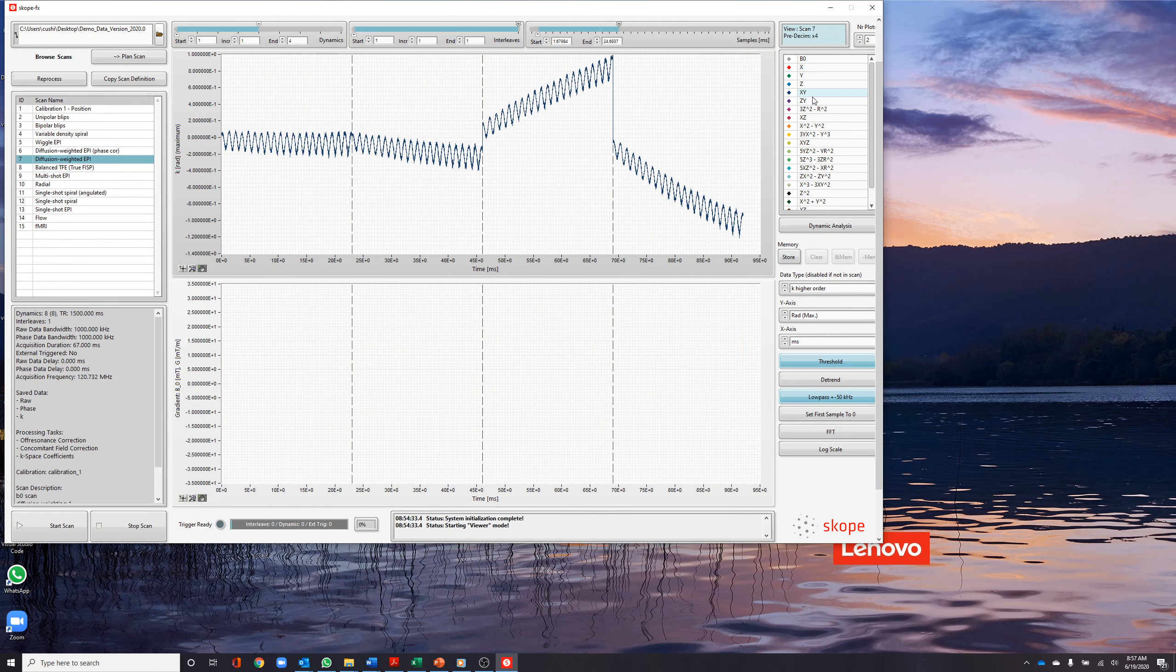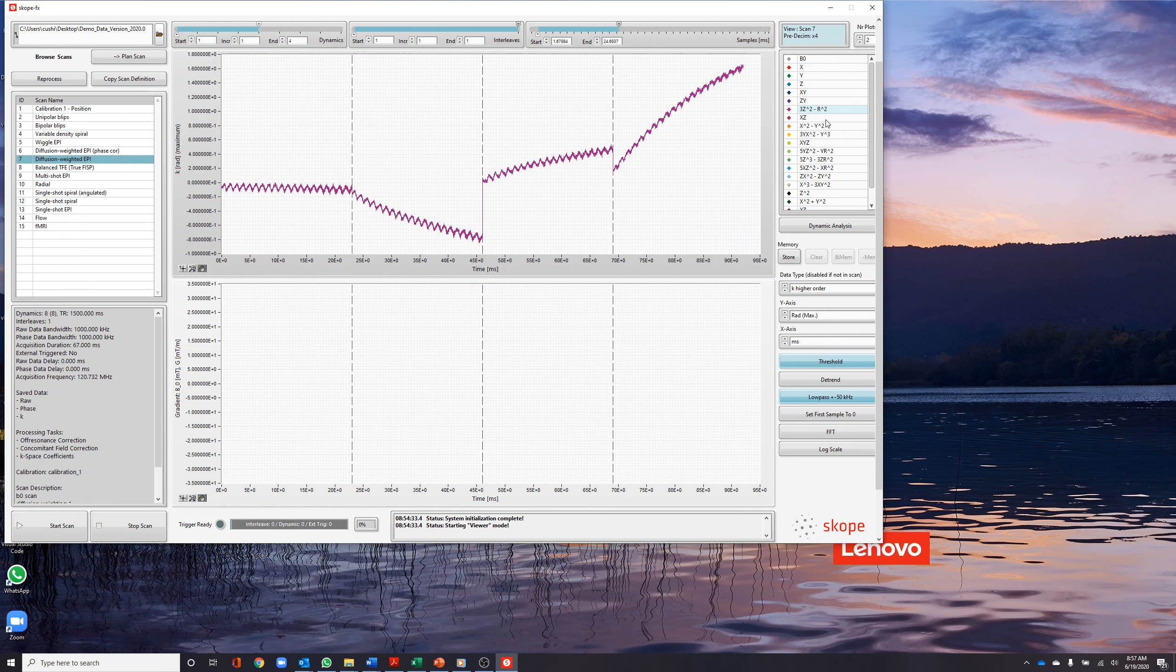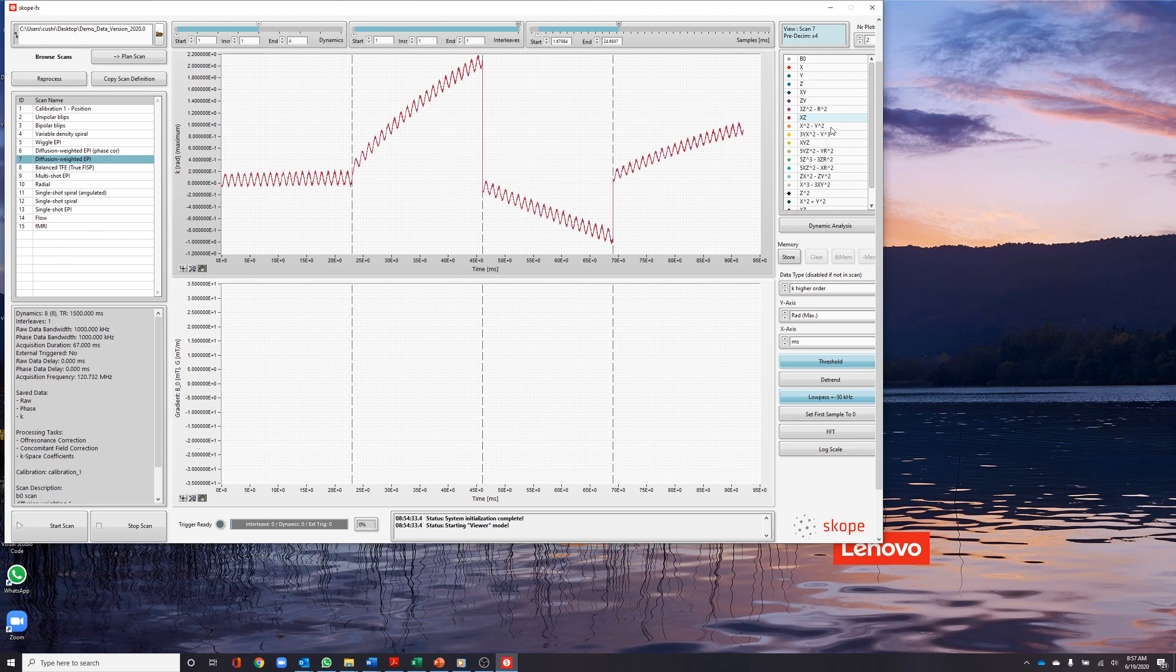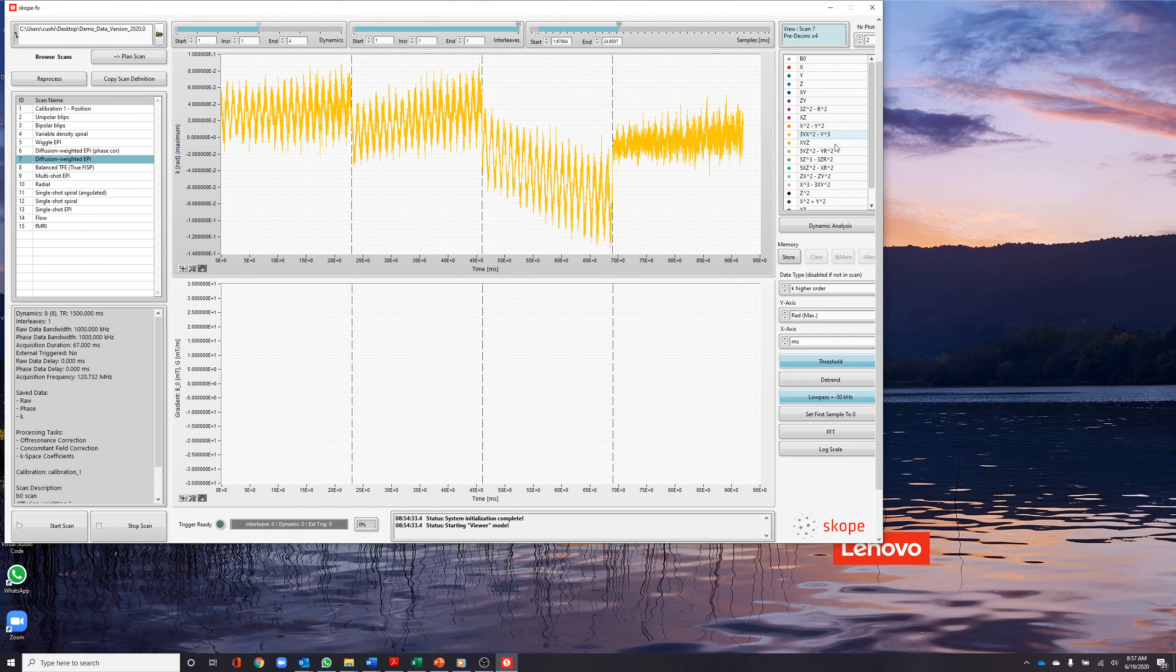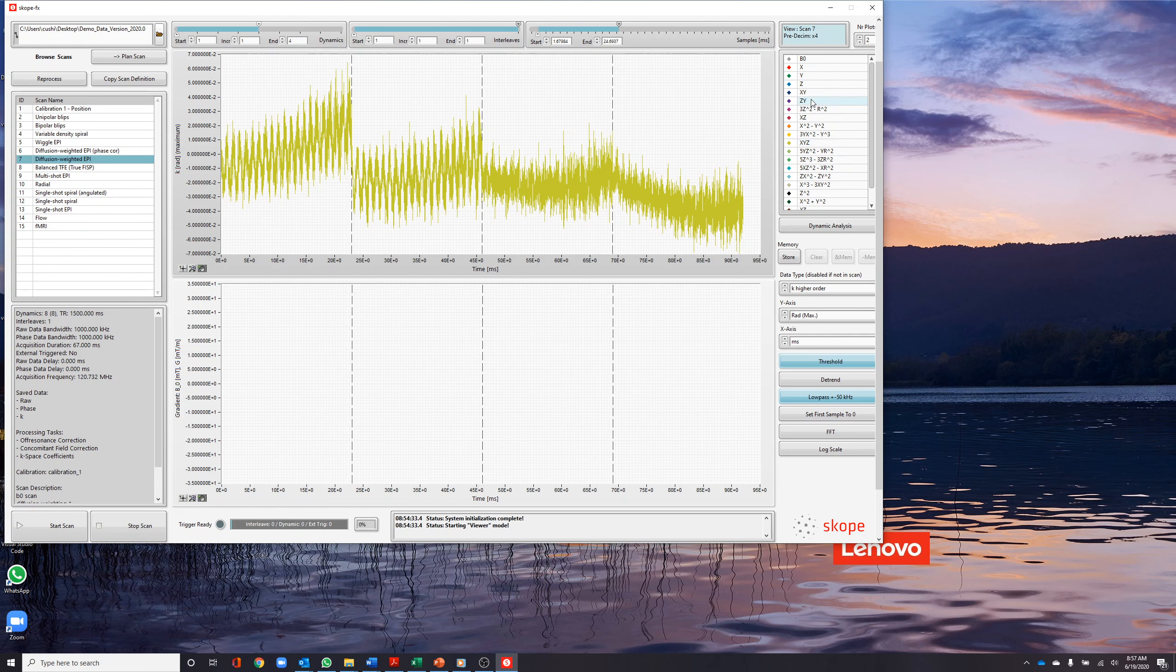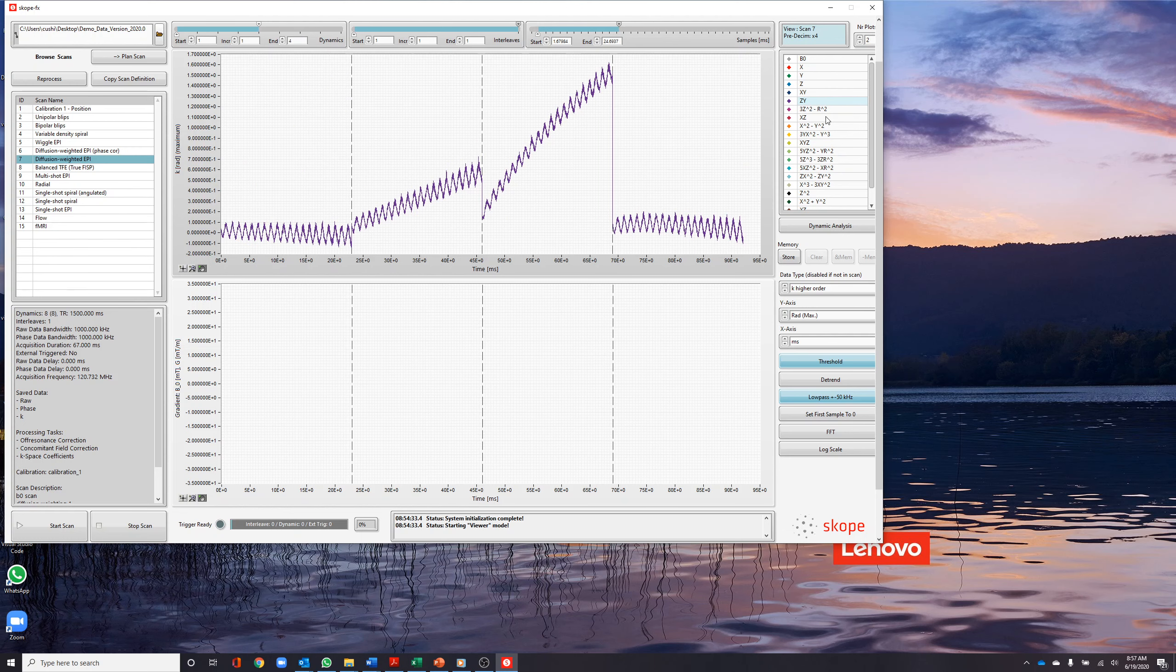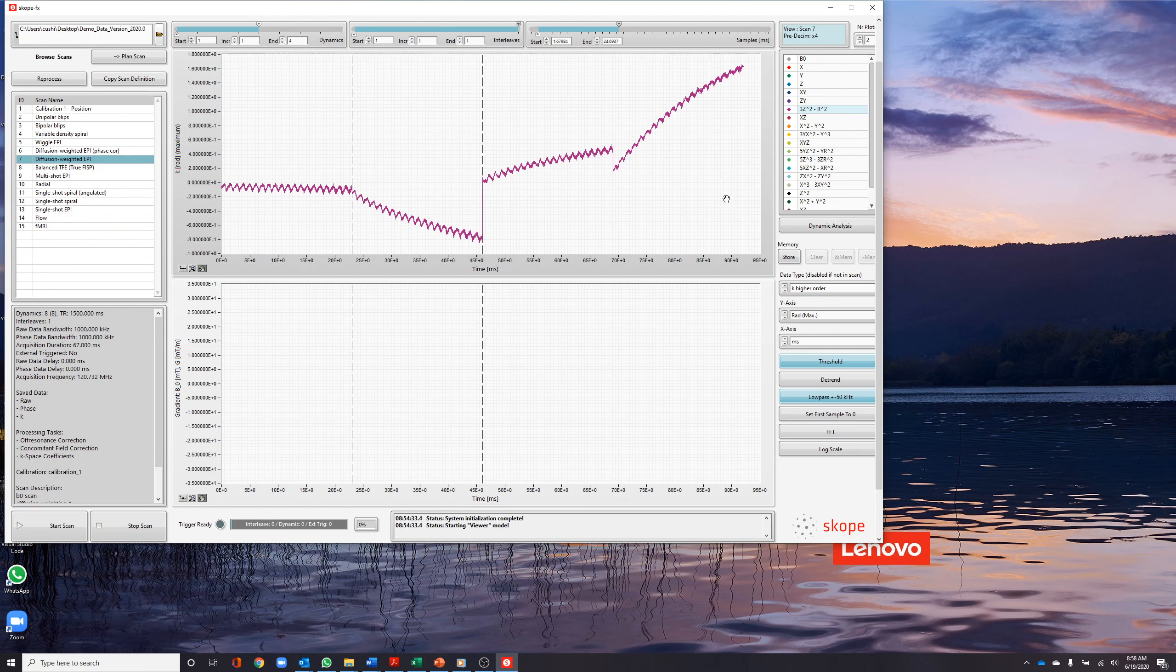The display screen now shows the evolution of the higher-order k-space parameters. We can scroll through the various higher-order parameters and see that the four dynamics have very different responses, for example the Zy and 3z-squared, R-squared terms. These responses are responsible for the characteristic scale and shear distortions seen in diffusion data.